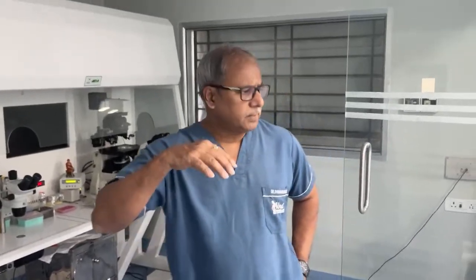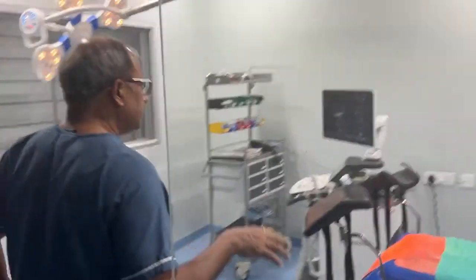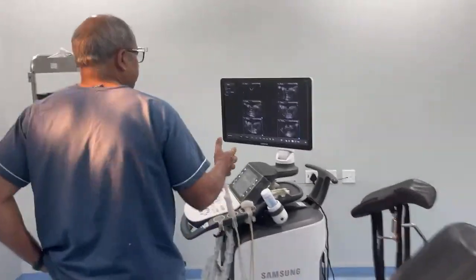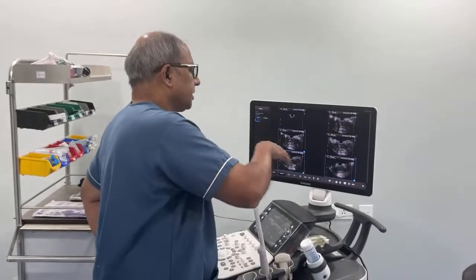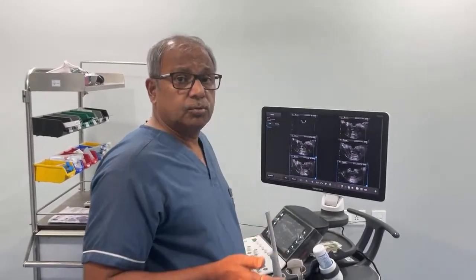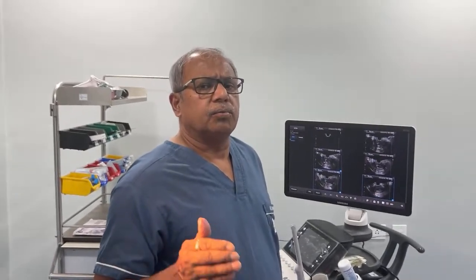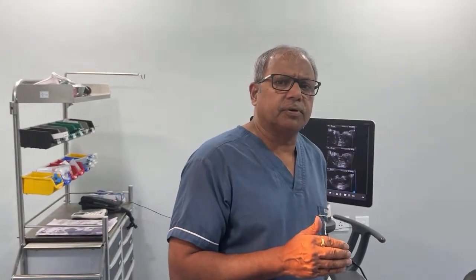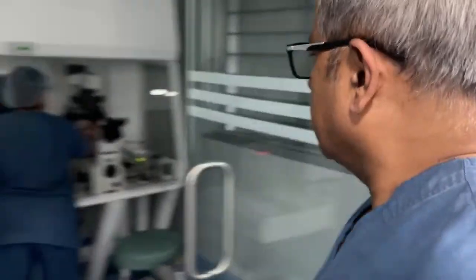This is our operation room, this is my embryology room, this is the ovum pickup room, and this is the ovum pickup ultrasound. This ultrasound picture can also be transmitted through the OR1 system, and whenever we do a workshop here for ultrasound guided procedures, these guided procedures can be transmitted outside.